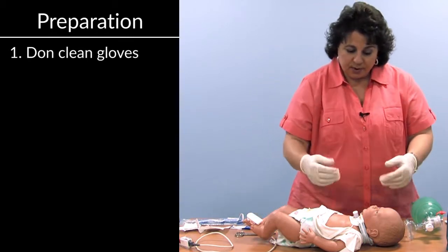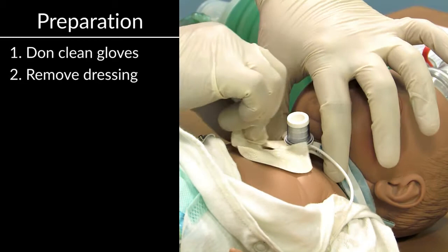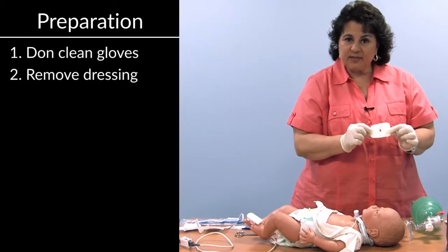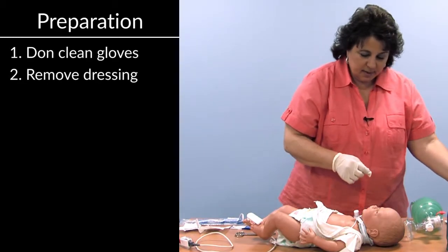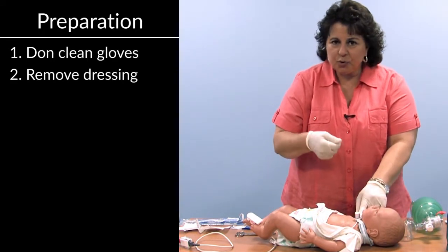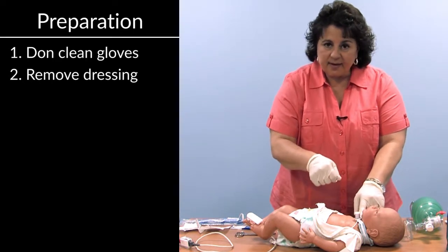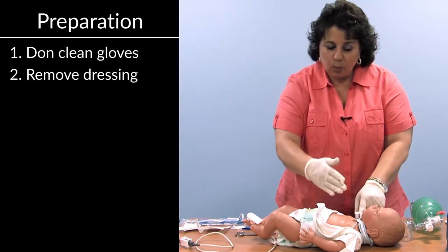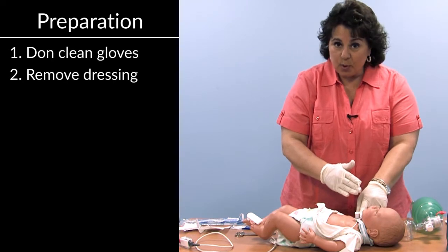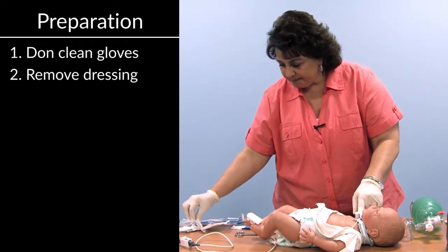So what we're going to do is remove the dressing that was on there before. This is a type of dressing called Exudry. This allows us to look at the site a little bit. I'm not going to take Q-tips now and gently take the time to clean the site, because I'm taking the tube out and I will wipe the site while it's exposed with my gauze that has moisture on it.